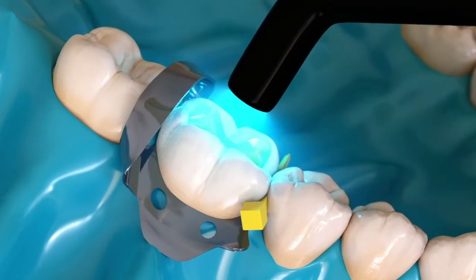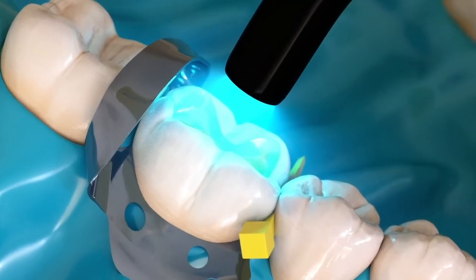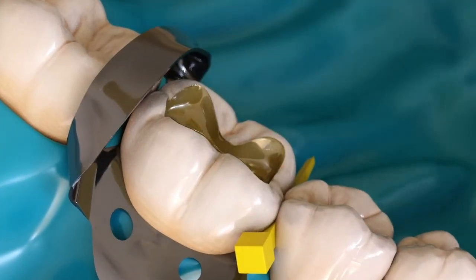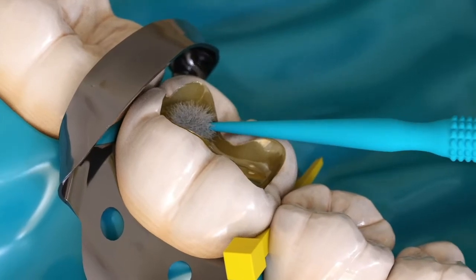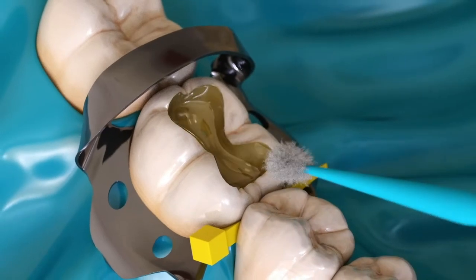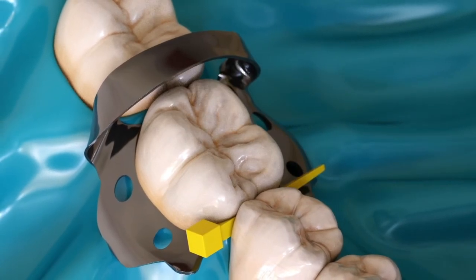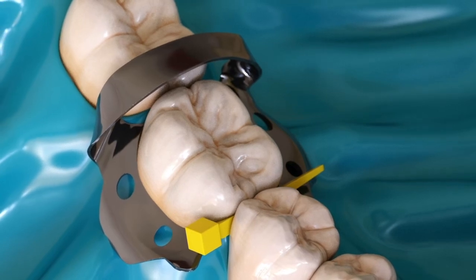Step 3: Light cure Therabase for 20 seconds, or allow it to self-cure. Step 4: Proceed with a bonding procedure such as All Bond Universal, following manufacturer's instructions. Step 5: Restore with a composite material following manufacturer's instructions.